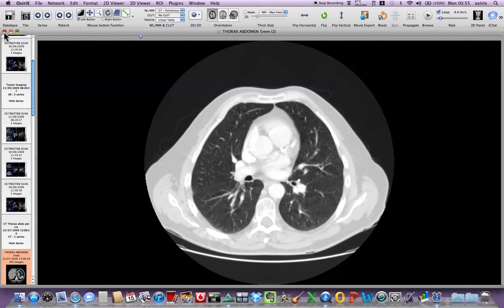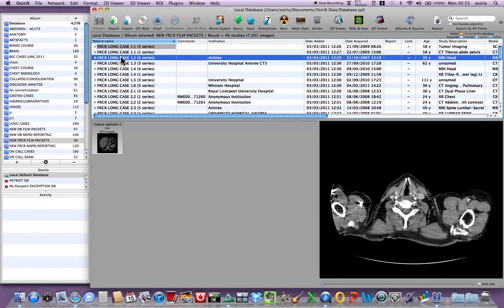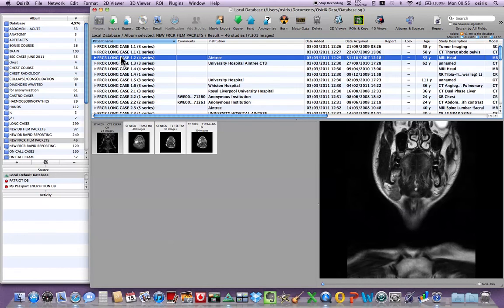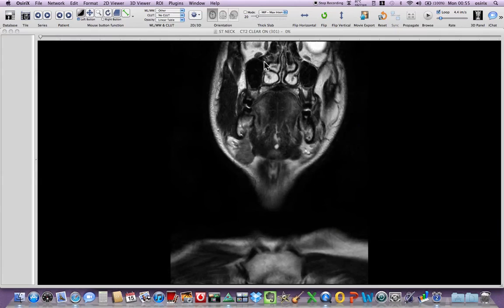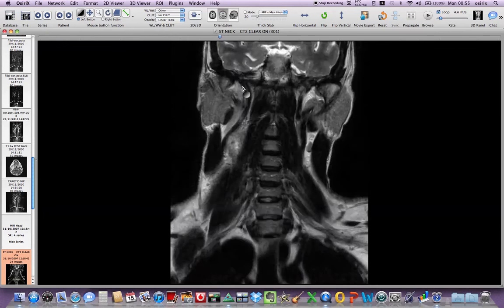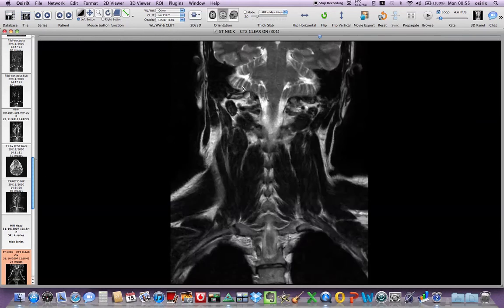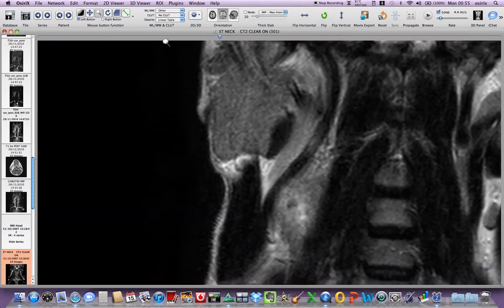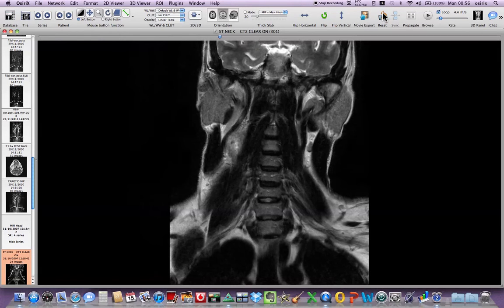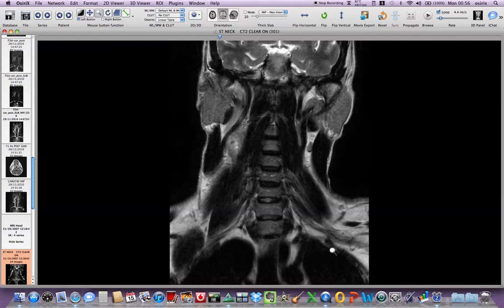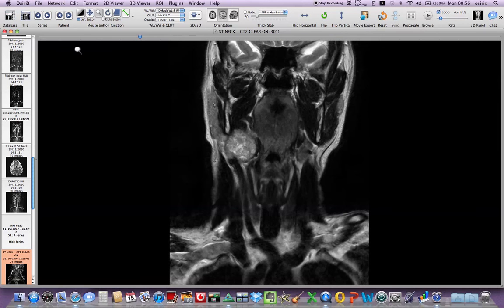Close that down and then go on to the next case which is 1.2. This case comprises four MR series. Double click again and we can scroll up and down. We can zoom in but always press the reset button to make sure that you're not over magnifying the film and missing things in the periphery. So that's very important.